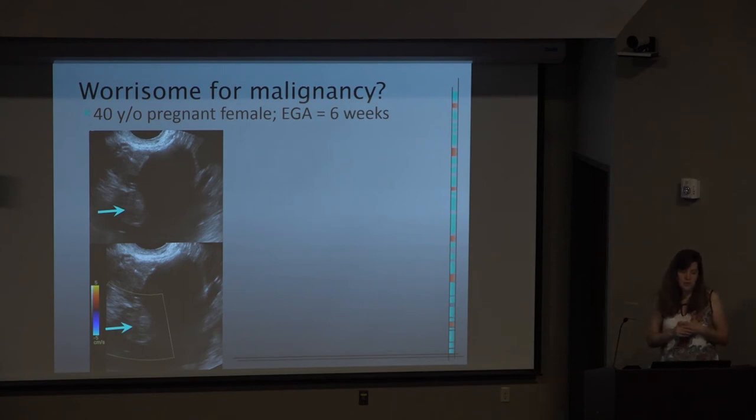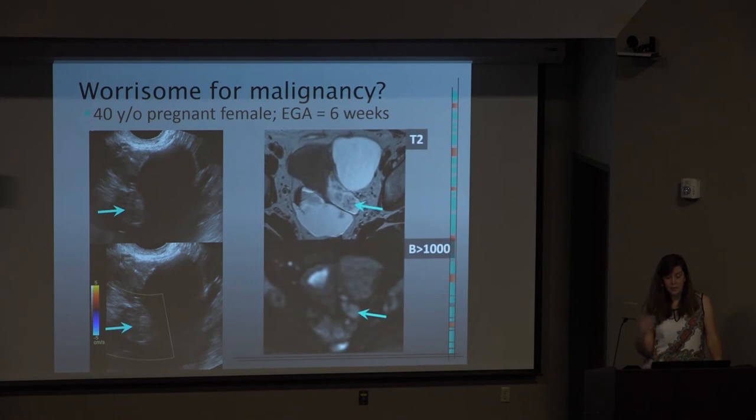So what do you do with these? You can obviously watch and wait. She's 6 weeks along. You can give her some time. Say it doesn't go away, it looks the same. What do you do? I personally think in these cases, you should probably go to MR sooner rather than later, because if it's benign, you're going to tell on MR, and if it's malignant, you're also going to tell on MR. Then you can counsel the patient earlier in her pregnancy on what to do.